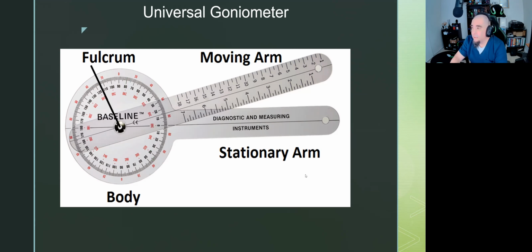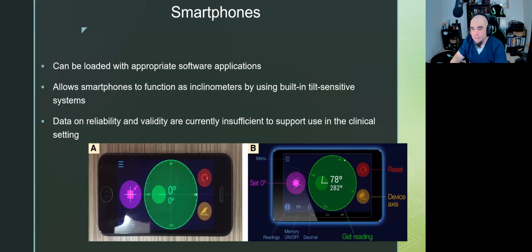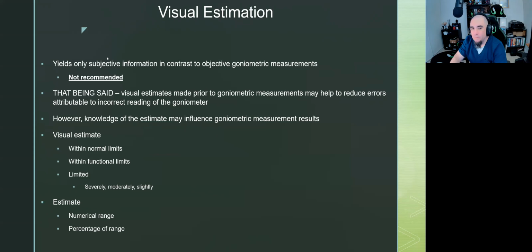Everyone's going to make that mistake. At some point, I've done it where I've looked and like, this patient has 360 degrees of shoulder flexion. No, they don't. I just messed up and read the wrong number. It happens, even to the best of us when we're doing things quickly. That's why it's good to keep a brain thought on what your estimation is at the beginning.